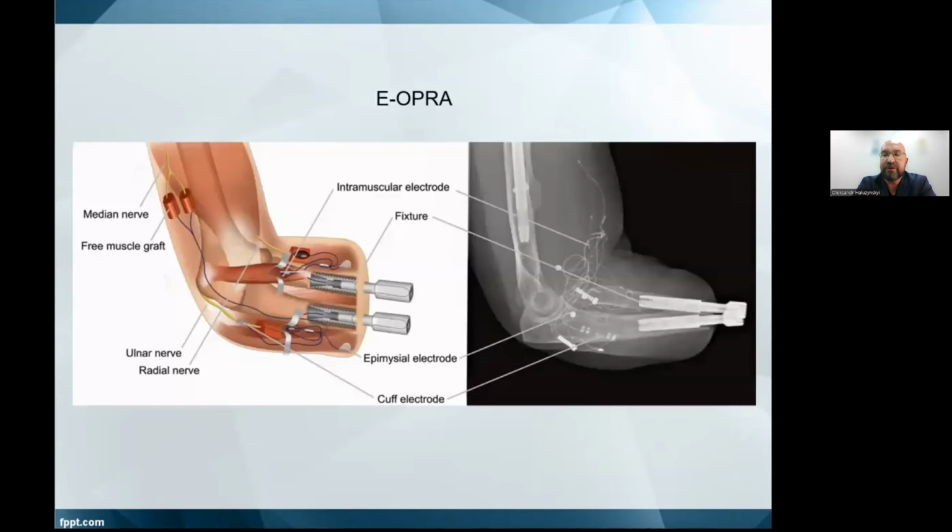Interesting that this patient with a short shoulder amputation stump works as a bioengineer in our laboratory of bionics. It's very cool for me. And this slide shows our future electronic prosthesis, a technology which is being improved, where electrodes are implanted into the patient's body and allow the prosthetic to move without interference.